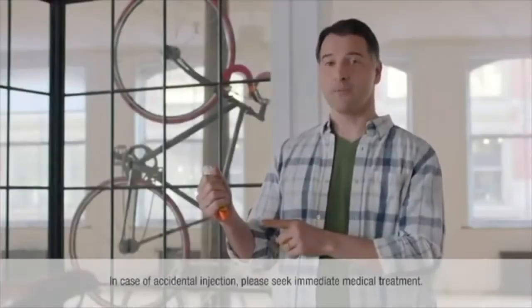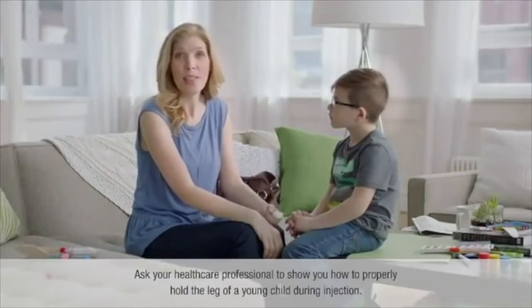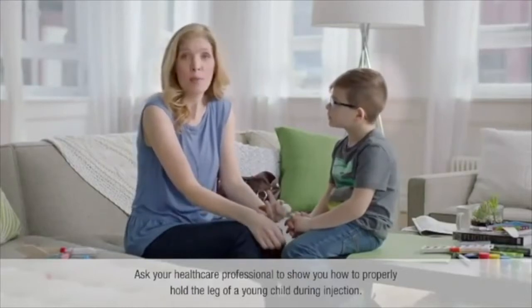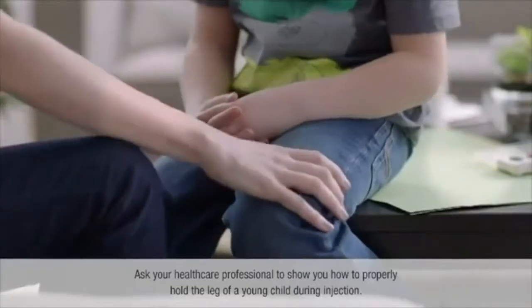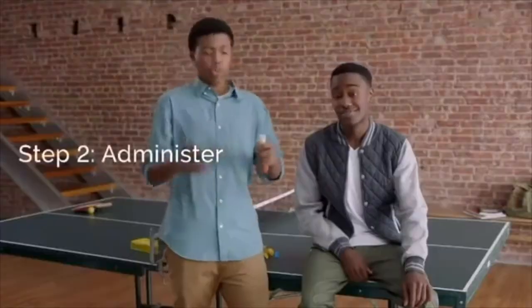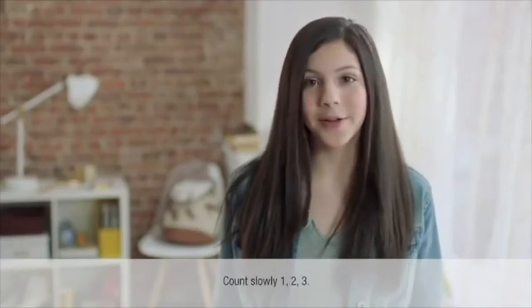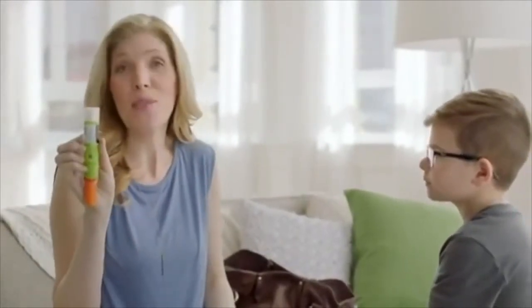Never put your hands near the orange tip, because that's where the needle comes out. The needle is designed to go through clothing, including jeans, because it must be injected into the outer thigh for quick absorption. If you're helping a young child, hold the leg firmly in place. Press it in — it clicks so you know it worked. Hold it there for three seconds, then remove the EpiPen. You'll still see some liquid in there, but your auto-injector gave you the right dose.